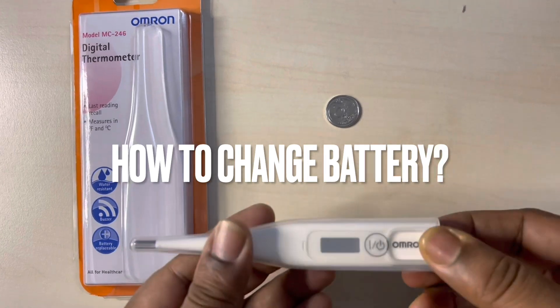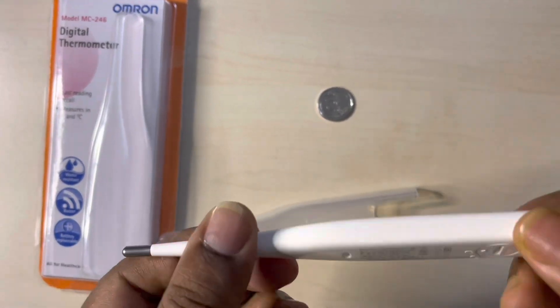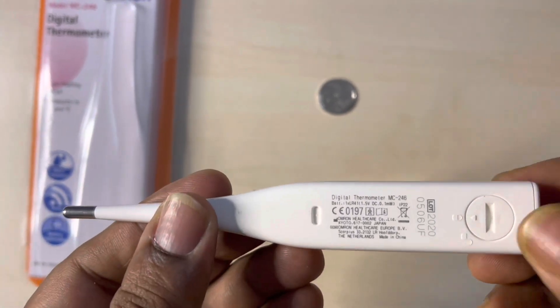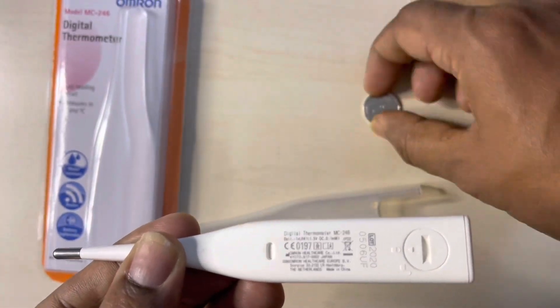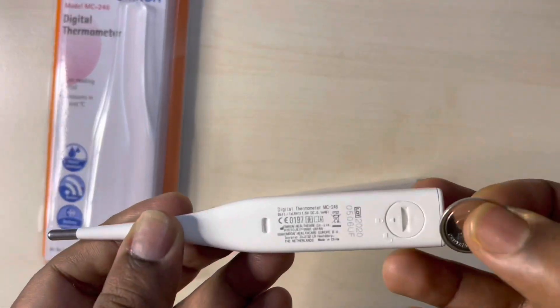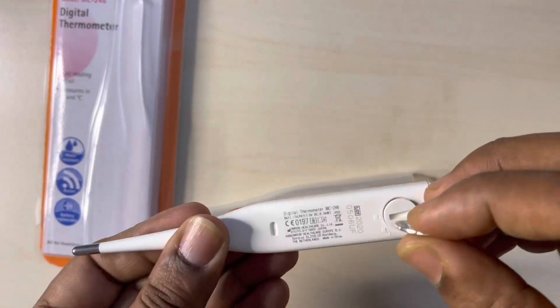You can change the battery in the thermometer — all you need is a round object or a coin. You can use a 10-cent coin to twist the opening and change the battery. It's very simple and convenient.